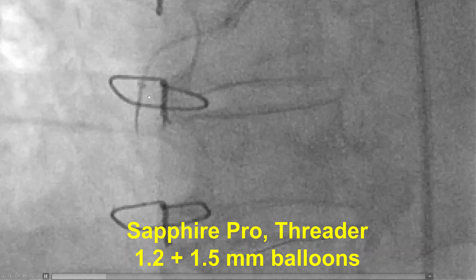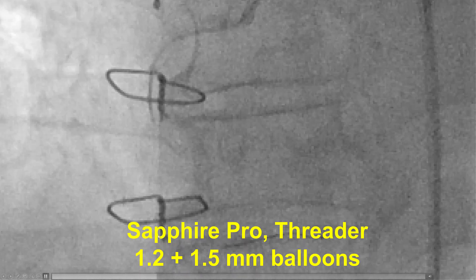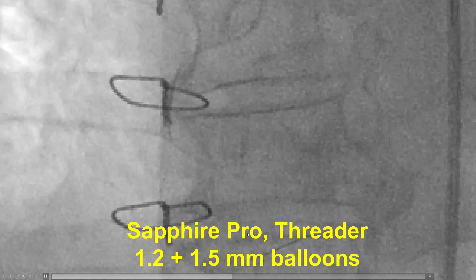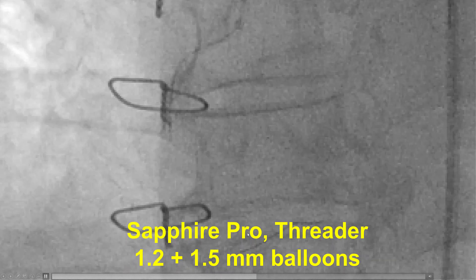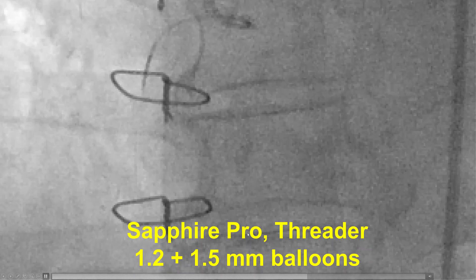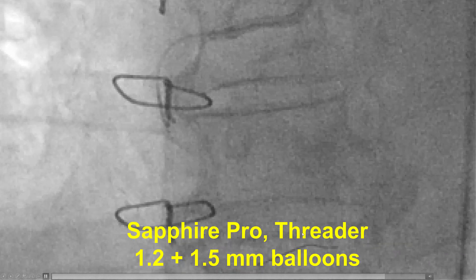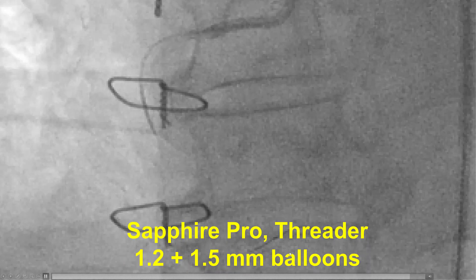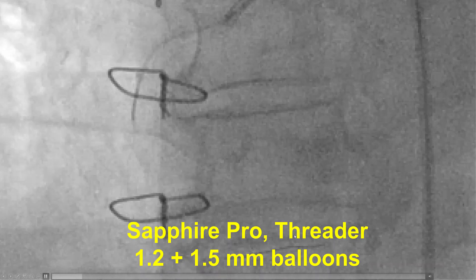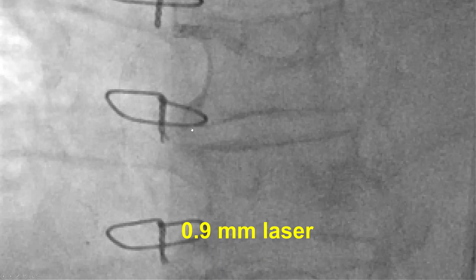We started with the smallest balloon available, specifically a Sapphire Pro 1.0, which is the lowest-profile balloon available in the US right now. Unfortunately, it didn't cross. We also tried the Threader and several 1.5 balloons. Despite performing grenadoplasty, we were unable to cross the lesion.